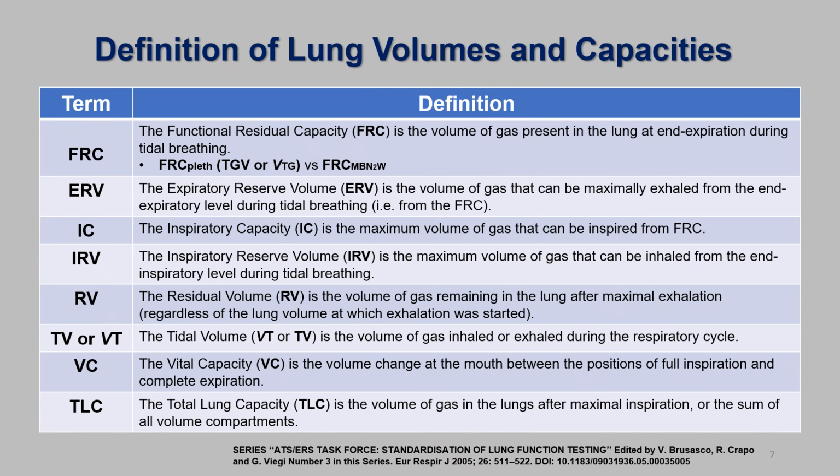The term lung volume or static lung volume usually refers to the volume of gas within the lungs as measured by body plethysmography, gas dilution, or washout. In contrast, lung volumes derived from conventional chest radiographs are usually based on the volumes within the outlines of the thoracic cage, and include the volume of tissue, whether normal or abnormal, as well as the lung gas volume. Lung volumes derived from CT scans can include estimates of abnormal lung tissue volumes, in addition to normal lung tissue volumes and the volumes of gas within the lungs.